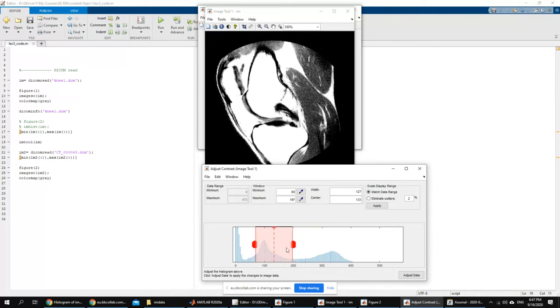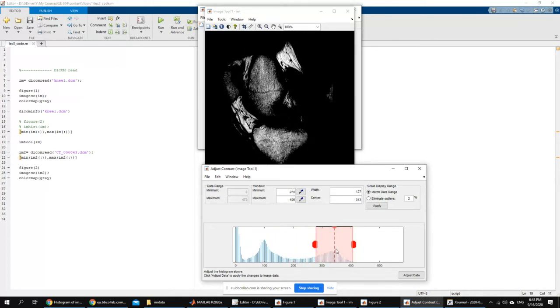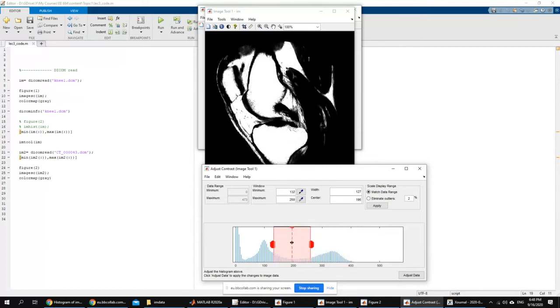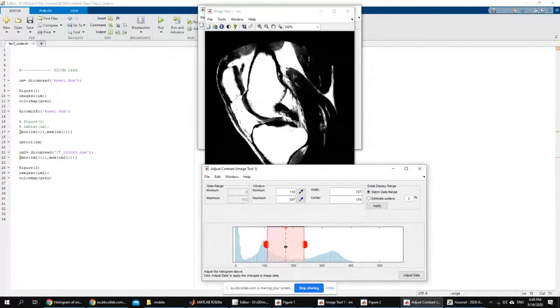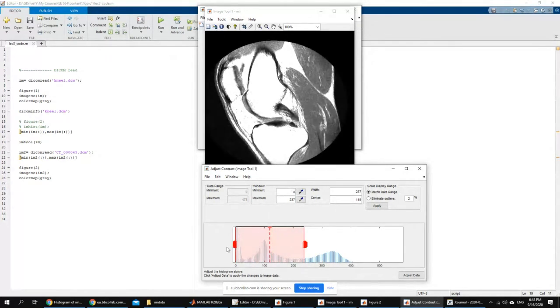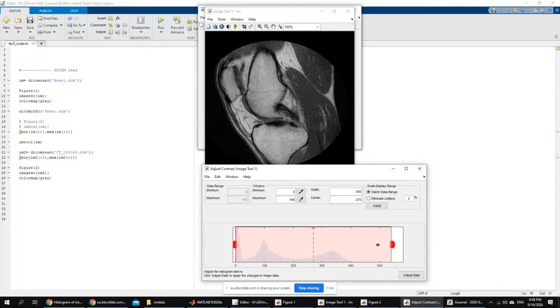By the way, if I move it to get that other one, it's the same thing. It's combining things that are different. These are bones. These are, I think, either ligaments or cartilages. They are not the same. So it's very rarely when people actually use such adjustment for MRI. But sometimes, if the doctor wants to see something in a little bit different color or a different display technique, sometimes they do that. But usually, the original image is good enough.